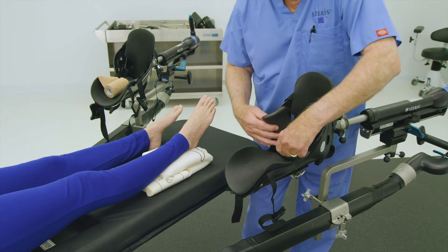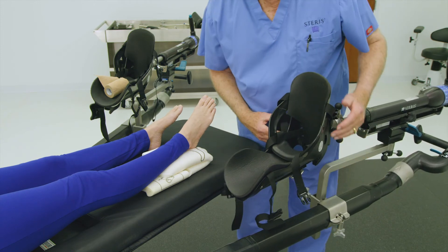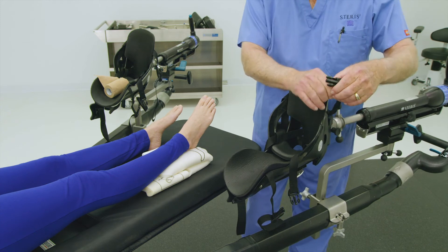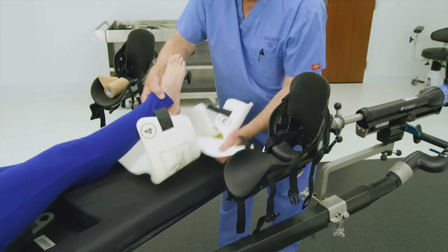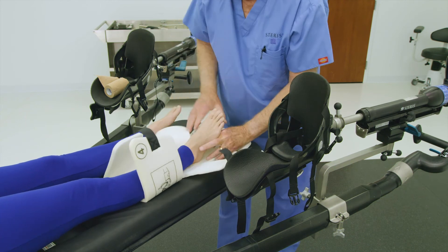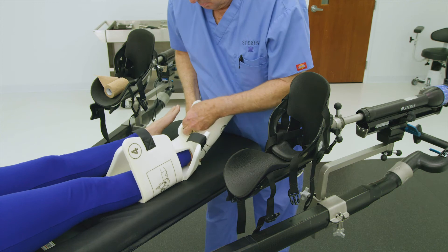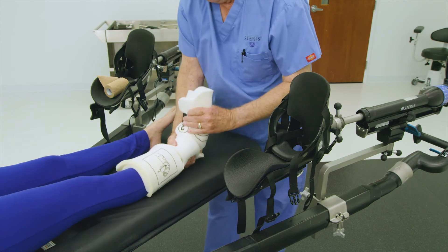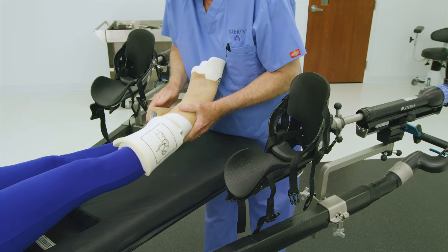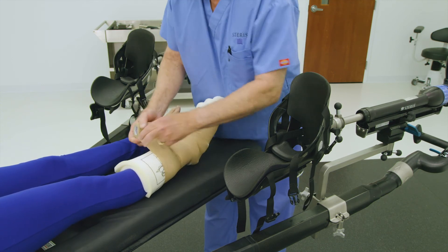Loosen the strap by pulling outward. If the buckles on the boot straps are not released, open the three buckles by squeezing tabs and lace straps over the exterior of the boot. Before placing the patient's foot in the traction boot, it must first be placed in a Steris traction boot disposable pad or prepped using local OR materials such as gauze wrap and coban. If using the Steris disposable pad, instructions for placement are located on the disposable pad itself.